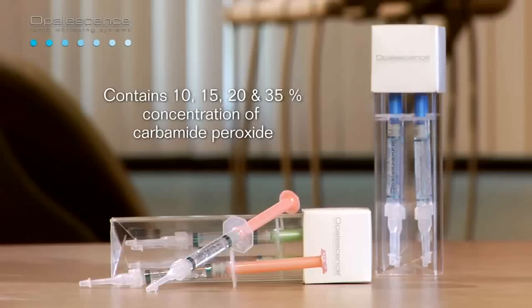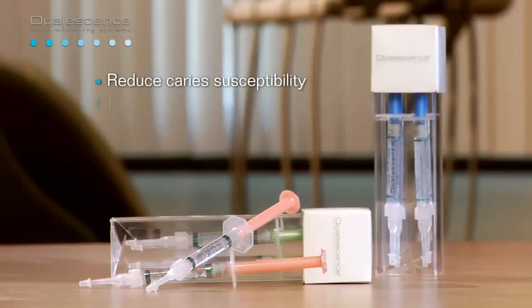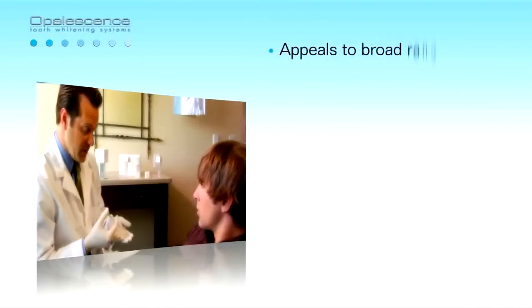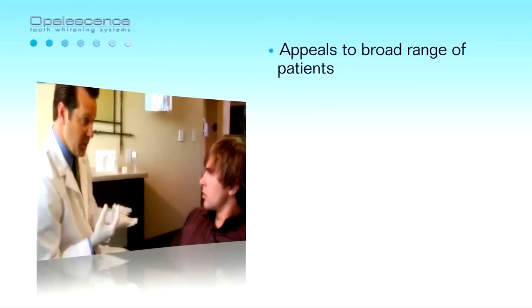In addition to whitening, Opalescence is the originator of the exciting PF formulations, which have been proven to reduce caries susceptibility, lower sensitivity during and after bleaching, improve the micro-hardness of the enamel, and improve enamel health.